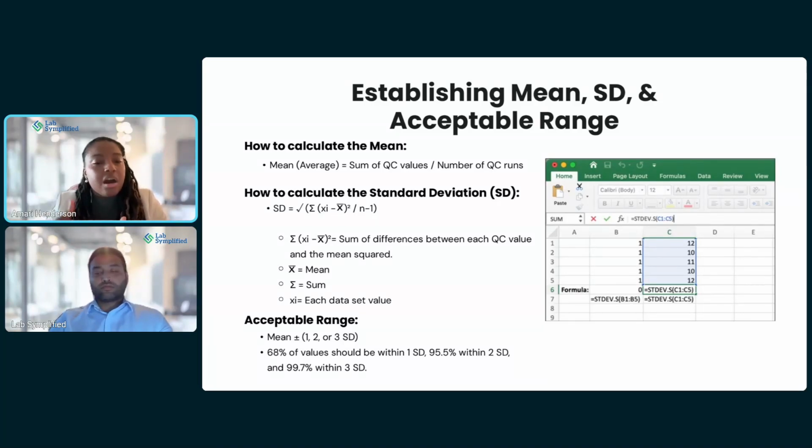To get the upper end of the range, you're going to add to the mean. To get the lower end of the range, you're going to subtract from the mean. A lot of times I find that those basic things, maybe people just don't grasp in school, or maybe it's kind of brushed over. So those basic skills of calculating standard deviation and different calculations, people just need assistance with, or they just need reminders for. So I do go over that kind of thing a lot from day to day.